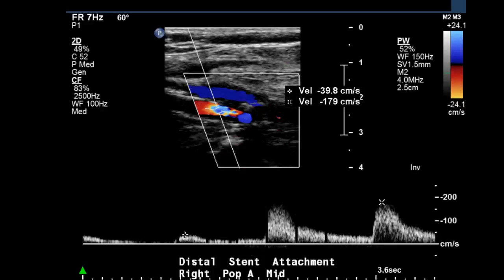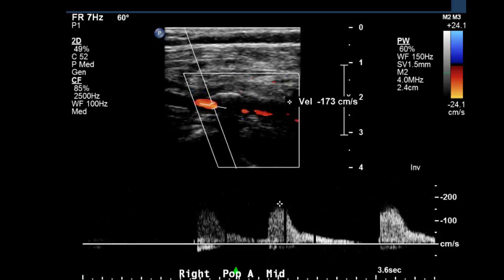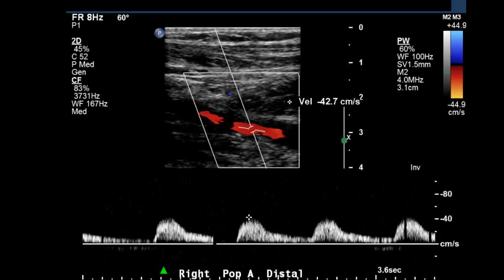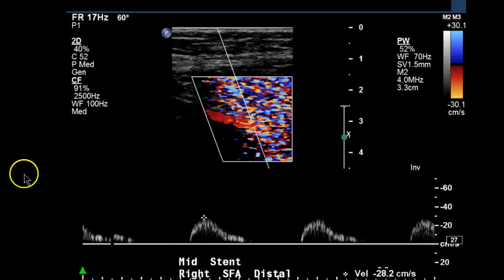And again, the pre-velocity increase and max site: we have basically 40 cm per second to an increase of 179 cm per second. Continuing on and taking several more velocities, they went back to the mid-stent distal SFA, just showing the abnormal waveforms here — this blunted monophasic waveform.